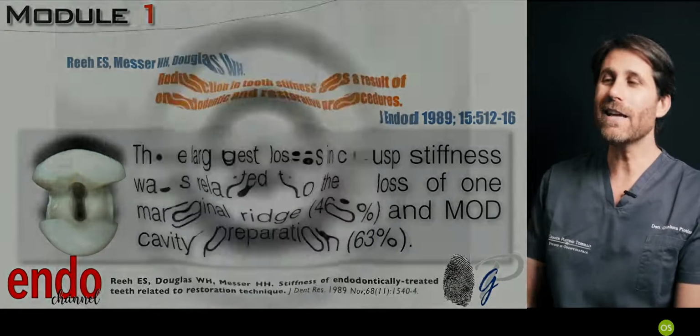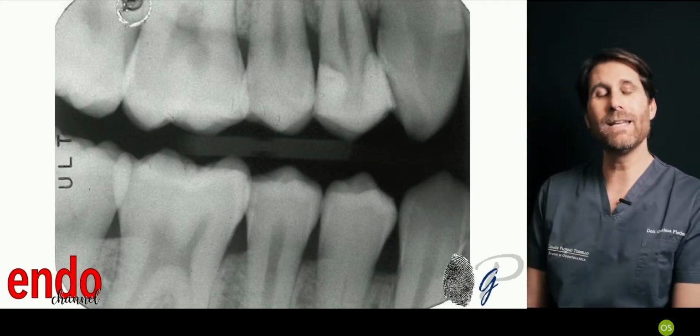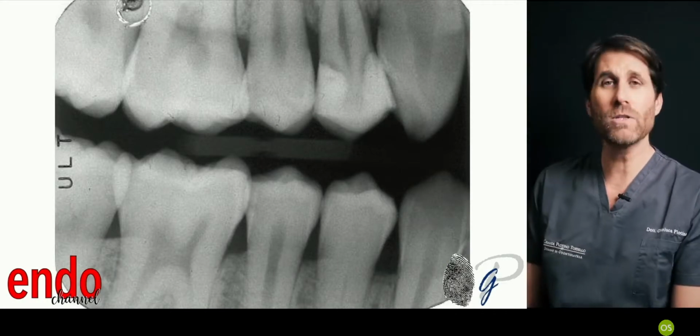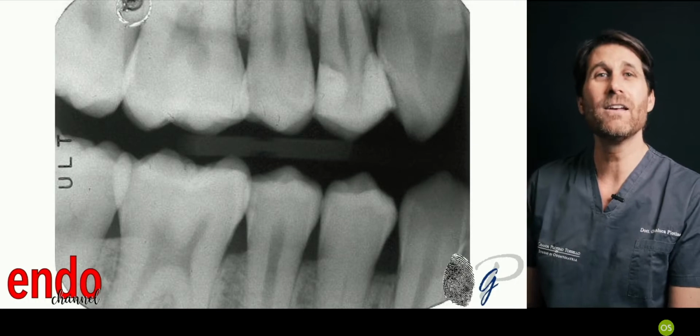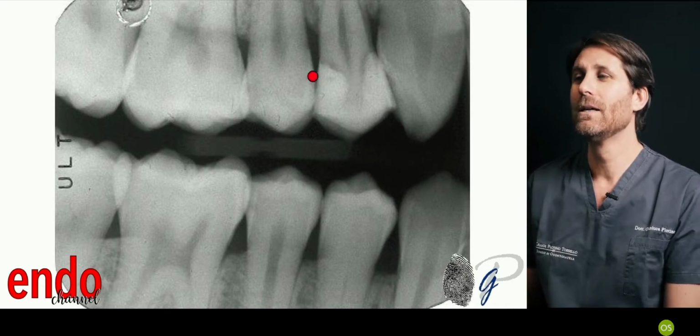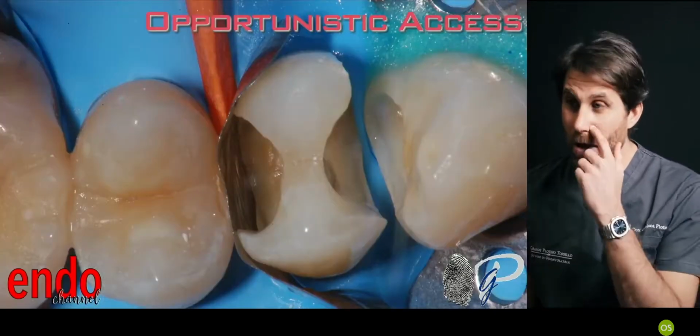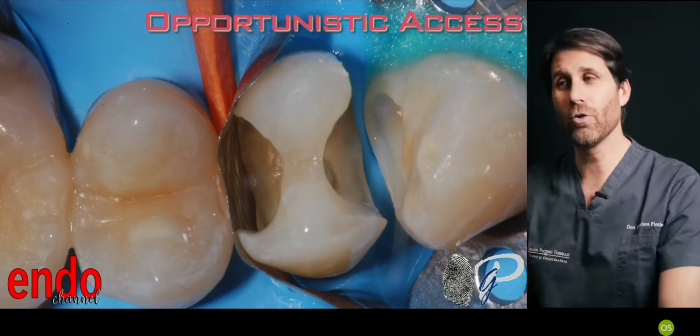So in this case, we also have to address the needs of the patient. This was a patient that couldn't afford any difficult restoration. In this upper premolar, the first upper premolar with two old big fillings, decayed, penetrating the pulp chamber, we had to perform the endodontic treatment.